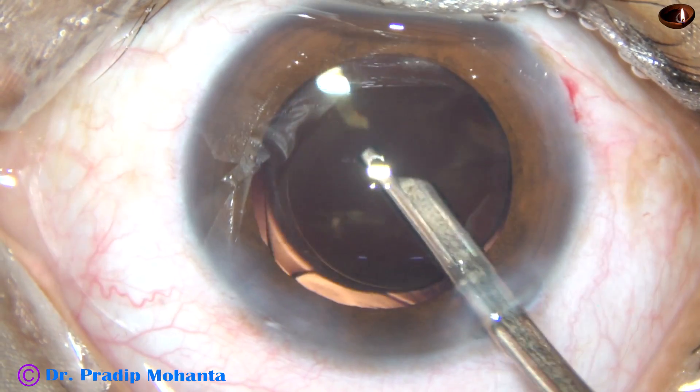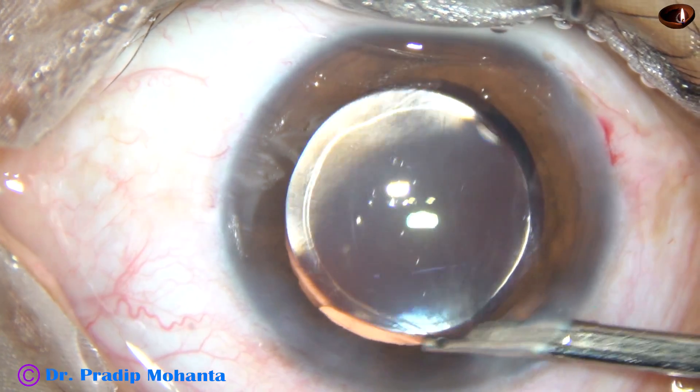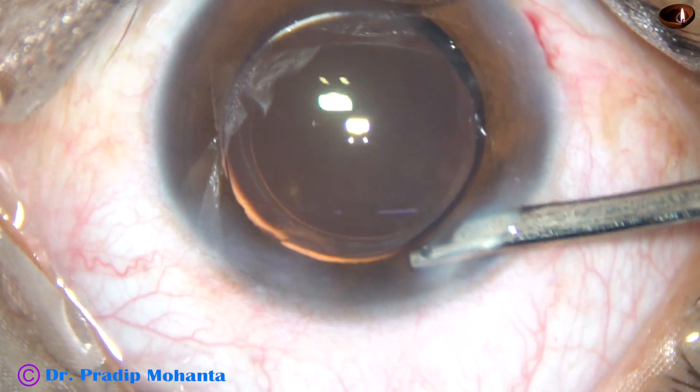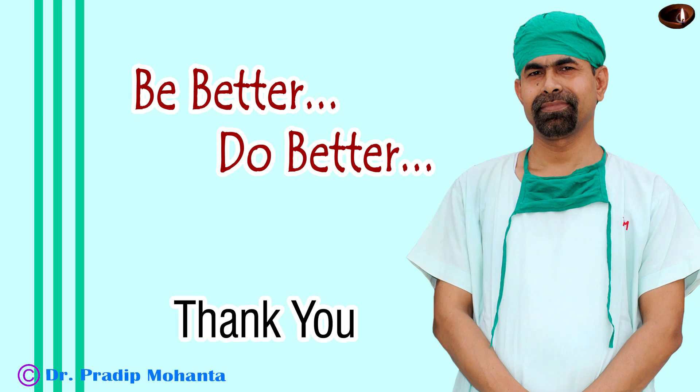The patient goes home the same day after four hours, after getting IOP checked by a non-contact tonometer. The anterior chamber is nicely formed and the case is concluded. Thank you very much for your attention. Hope this video will help you in developing your surgical skills. Be a great surgeon and serve mankind with love, respect, compassion, and great competence.